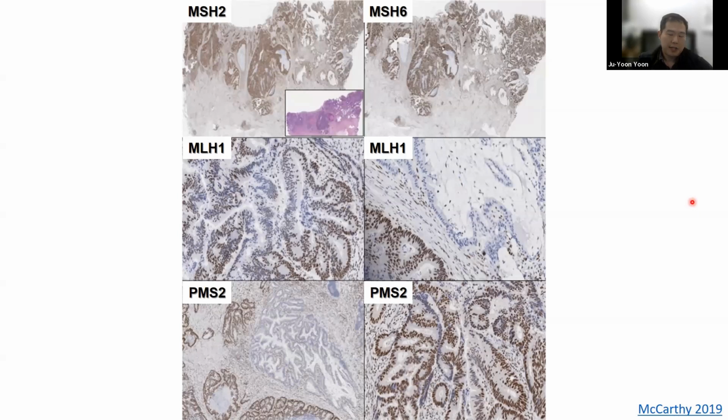I don't usually sign out GI, so colorectal carcinoma is not something I usually look at, but certainly this is also seen in the GI world, and this is actually a paper from the EHN group when Dr. Ranjan Pichetti was still there. It can be seen there as well, with geographical loss of MLH1 and PMS2, but this case also had heterogeneous expression of MLH1 and PMS2.